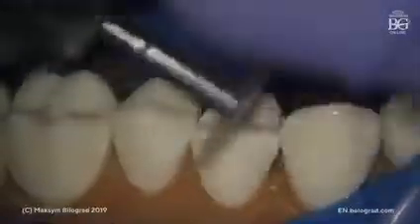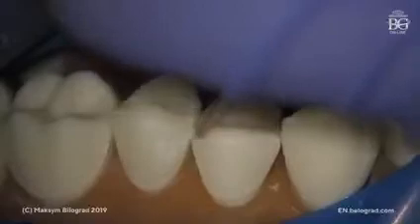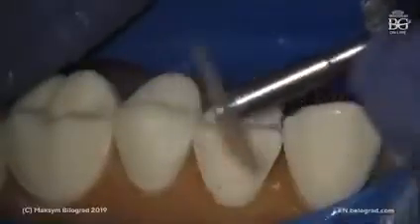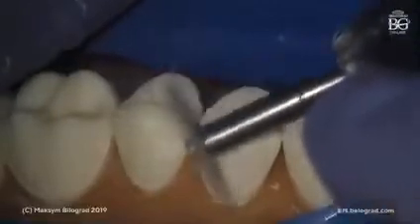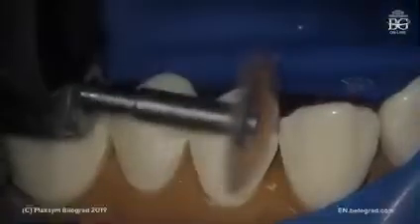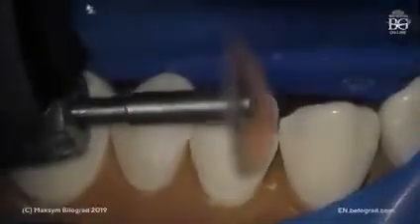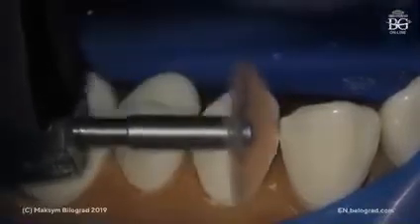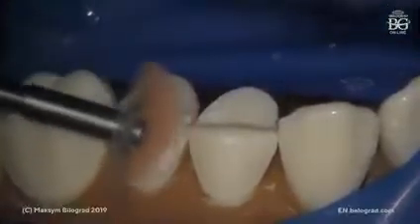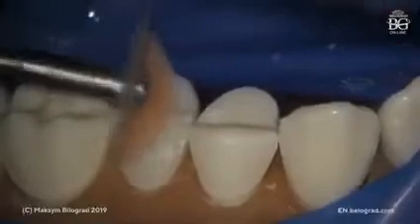It's easier than with a burr. Okay, so now let me change the abrasive area of the disc internally, and then we just make some buccal surface smoothening. Again, don't touch the finish line, because it will be a problem later on. If you touch the finish line with the disc, there will be no finish line. It will be difficult for the dental technician to identify this finish line.